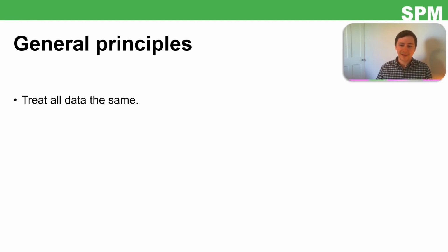That's important because these artifacts in your data might be orders of magnitude larger than the signals. So if somehow you attenuate an artifact 80% in one condition and 90% in another, you'll very likely find a difference, but it's nothing to do with the signals you were trying to measure. I guess it's a bit more complicated than that, really, but that's the idea.